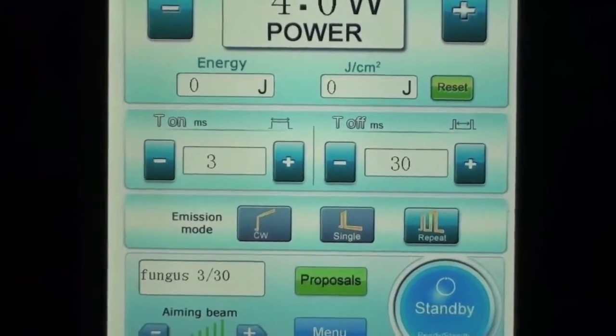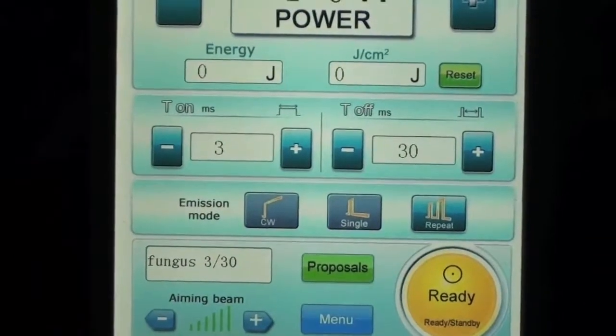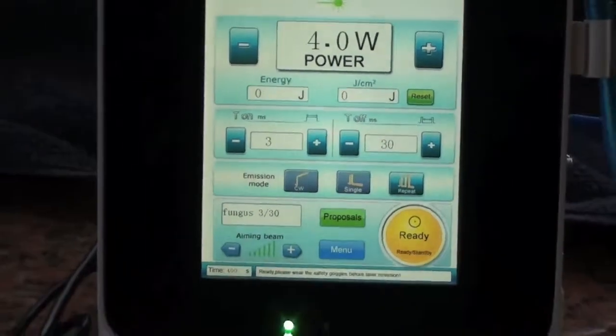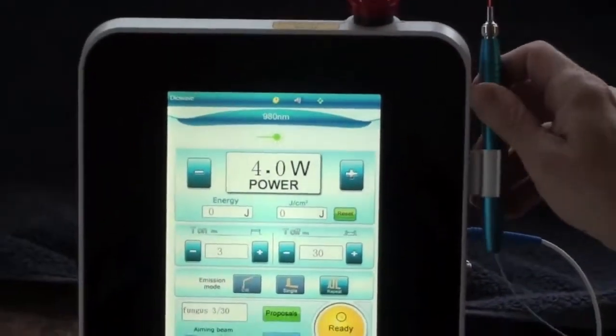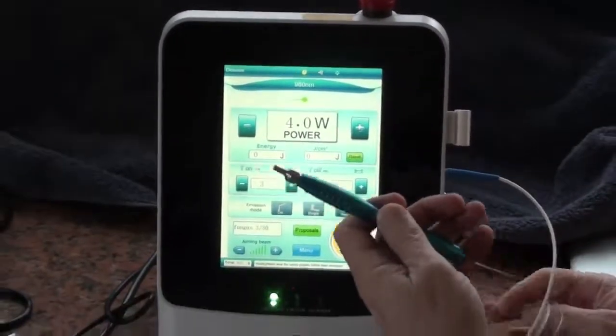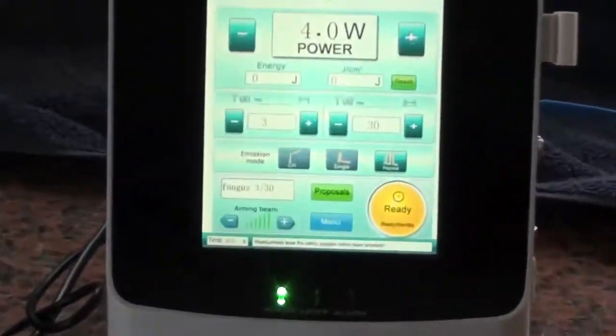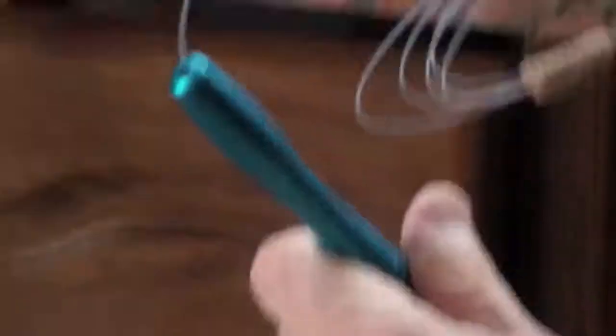If you want to use it, you turn it on ready. That will turn it on. You lift up the foot pedal. In this case, we're using the hand piece. This happens to be a 400 micron and there's the beam that's on. If you want to start it, you just press. It should press it down.